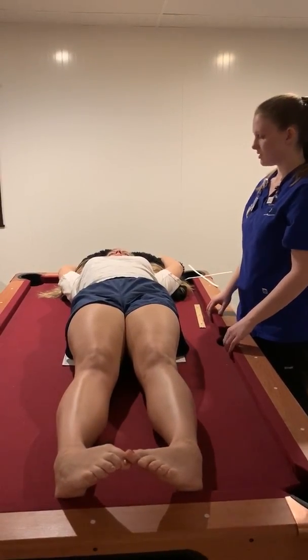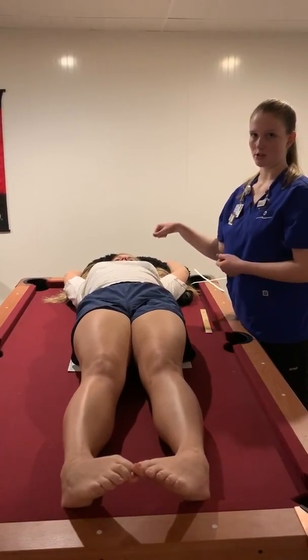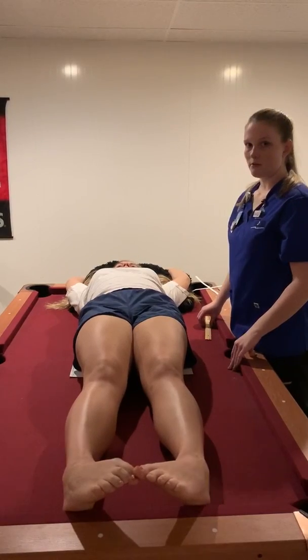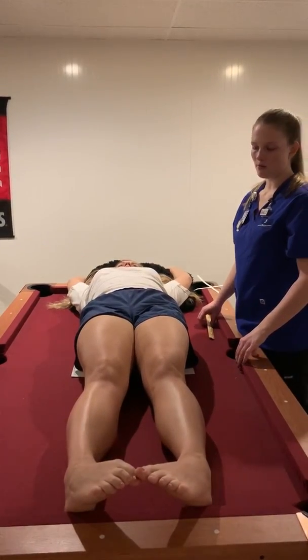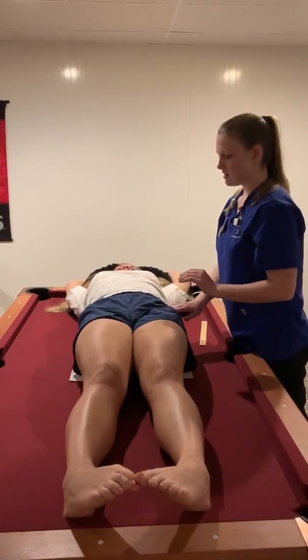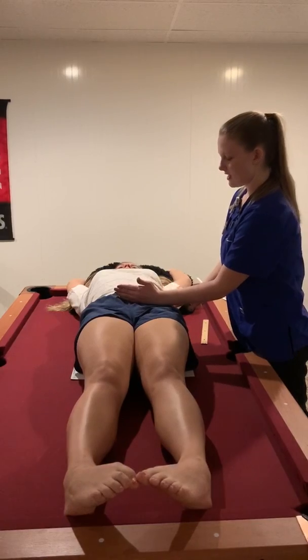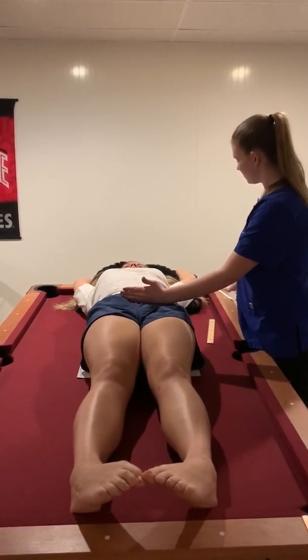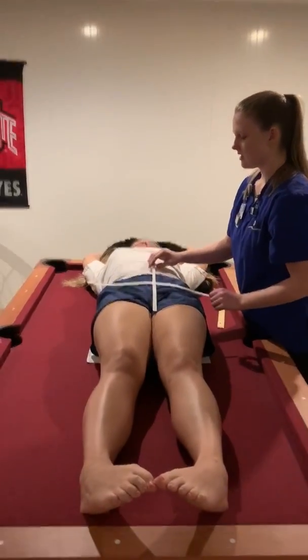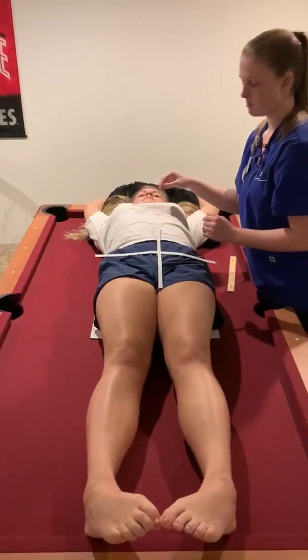Now I'm going to center. Since I have everything lined up, all I have to do is move the patient on the table. The centering for the AP pelvis is midway between the ASIS and the pubic symphysis, and you would also center midway on the midline of the body.